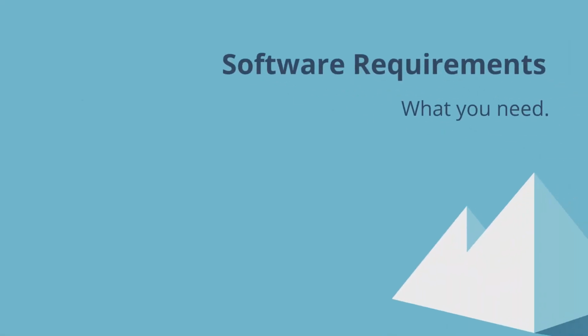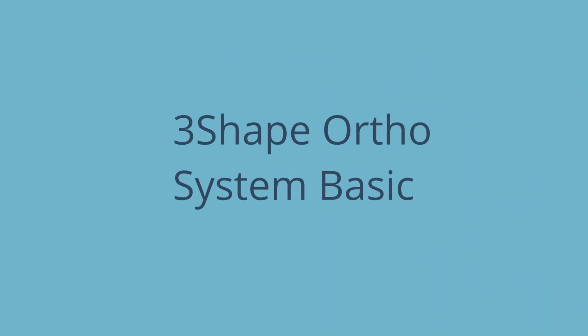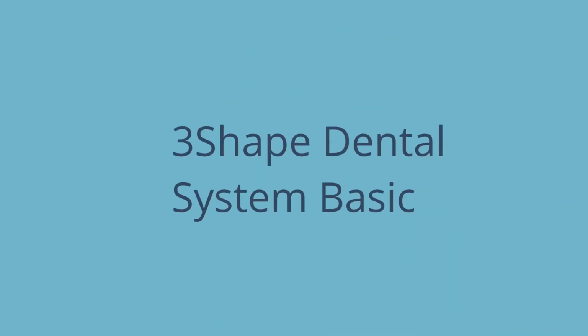Moving on, let's get into some of the software requirements. Fortunately, you can actually purchase Clear Aligner Studio as an add-on module to either Ortho System or Dental System. This is a huge convenience for dental labs that aren't necessarily ortho labs as well, but want to kind of transition into doing clear aligners. You can actually add this onto your dental system, which is a huge advantage.